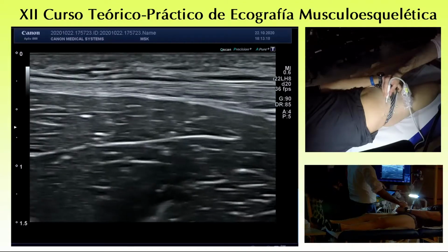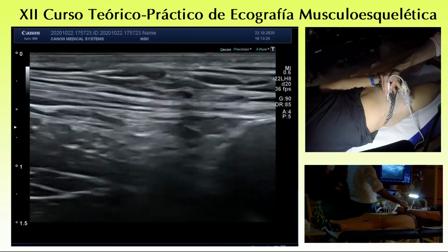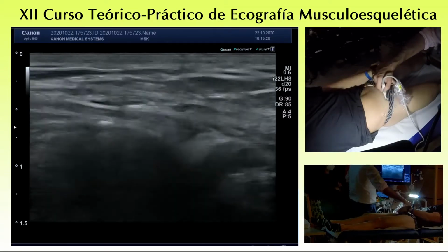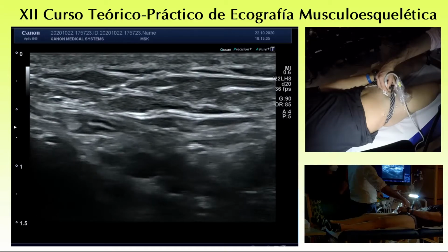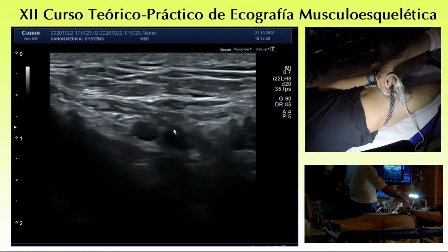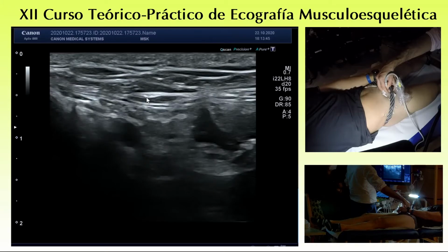You can follow distally until you recognize some vessels moving toward the pubic area. This is the spermatic cord, much magnified at this point, and you see that, for instance, this one could perfectly be one of the branches of the ilioinguinal nerve.